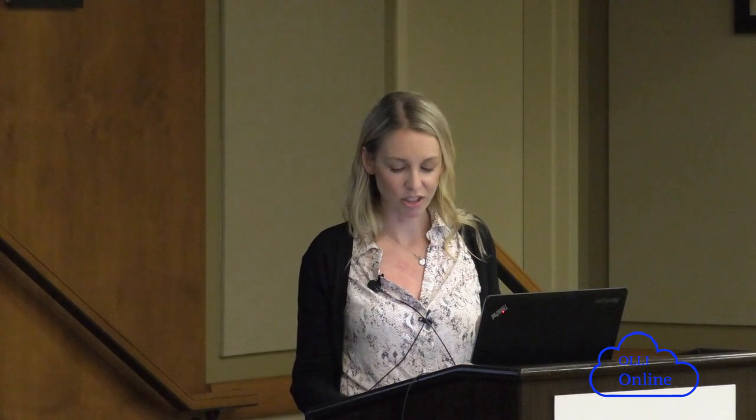The reason why we don't do screening ultrasound on everyone is it's very user dependent, it's time consuming. Sometimes the exam can take 20 or 30 minutes, and we find a lot of incidental little cysts and masses that probably will be of no consequence to a patient, but sometimes they lead to unnecessary biopsies, more follow-up. So we really don't want to have everyone coming in for screening ultrasound. We want it to be targeted at patients that have a higher risk or patients that have dense breast tissue.